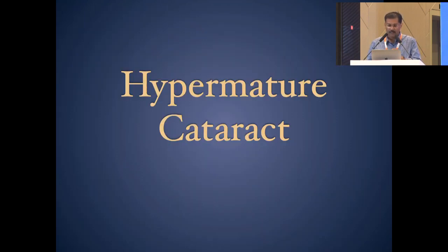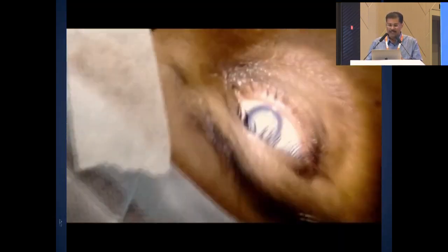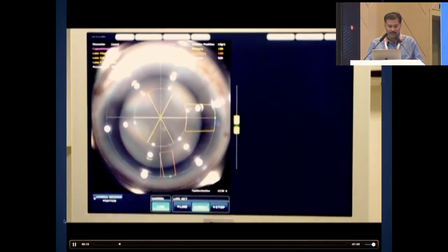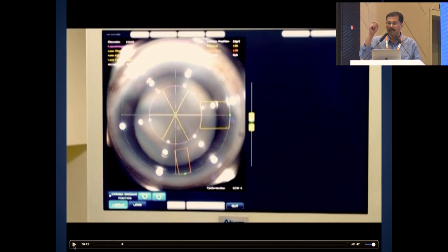One application for this is in mature cataracts, because sometimes it may cut through even small fibrosis; sometimes it will cut partially, sometimes fully. The problem here is that patients may not be able to focus on the blinking red light which they are supposed to look at straight. So the docking may not be that perfect in total and mature cataracts. Sometimes you need them to be blocked because of language issues, or patients who cannot hear and cannot cooperate at all. Then again, you should not have too much chemosis, and the eyeball has to be centered. You can use some forceps and other instruments to guide the globe till it gets docked straight.